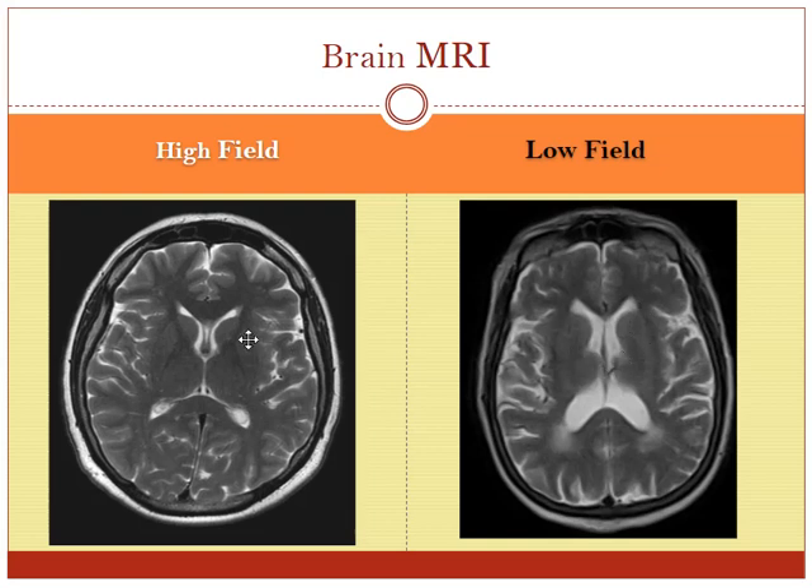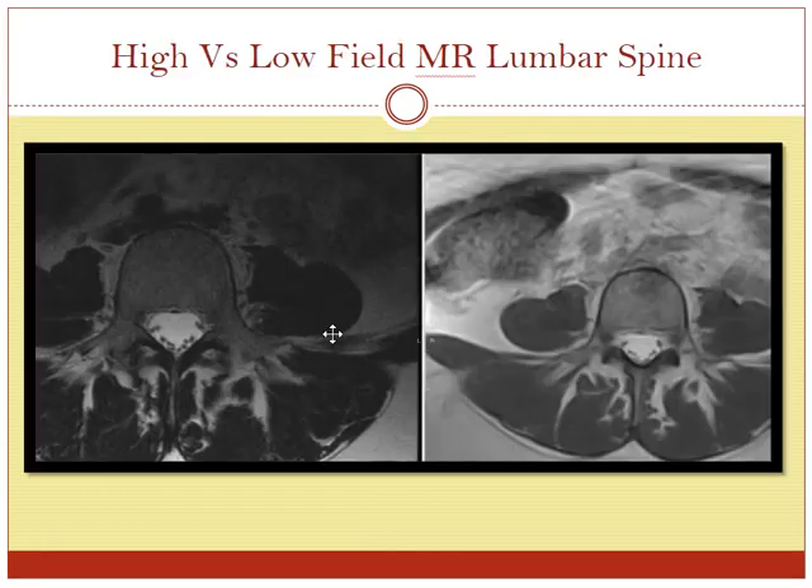This is a fairly typical example — the low field looks pretty good, but you can see it's just not quite as clean as the high field scanner. This is a view of the lumbar spine. On the left you see white fluid in the spinal canal and these little dots are the nerves going down through the spinal canal with the vertebral bodies. On the low field scanner on the right, the image quality is not quite as sharp and clean — the nerves in the spinal canal look reasonably clean, but the muscles are not quite as sharply defined, and tiny blood vessels tend to blur out.